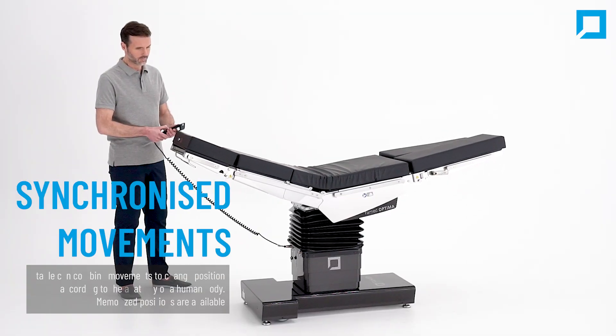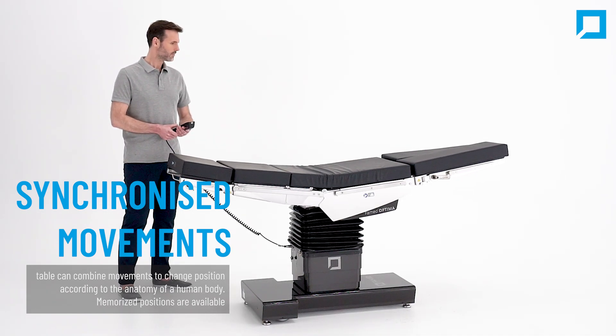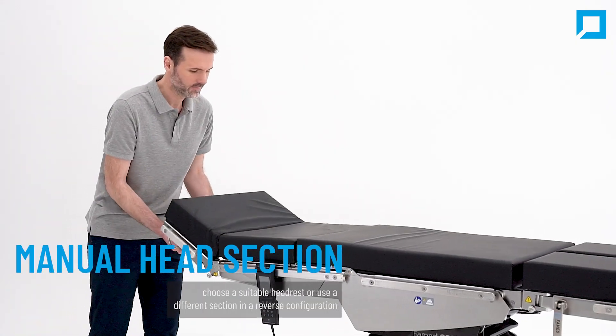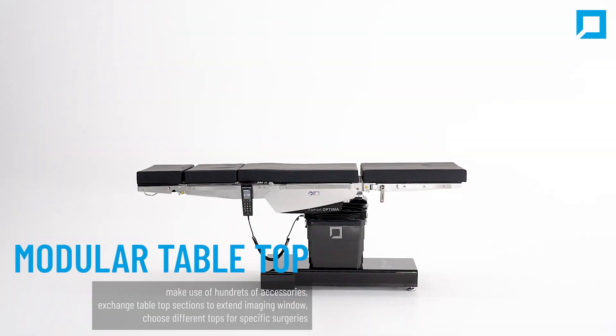The table can combine different synchronized movements to change position according to the anatomy of a human body. Memorized positions are also available. The head section is the only part of the tabletop that has to be regulated manually, and you can choose a suitable head rest or use a different section in a reverse configuration.